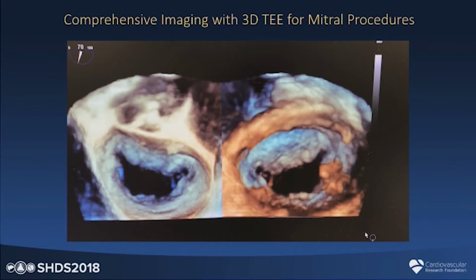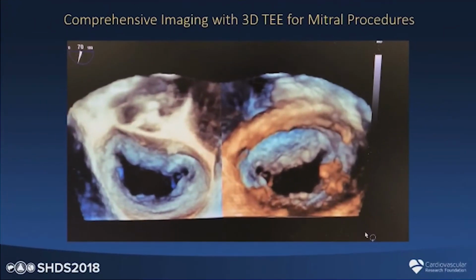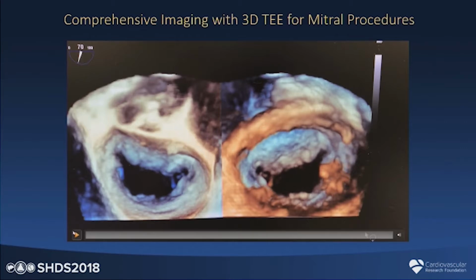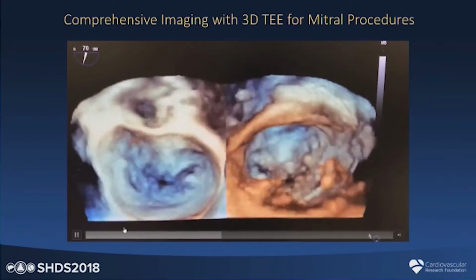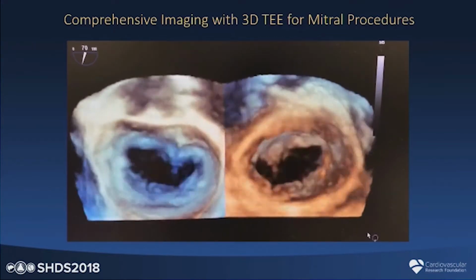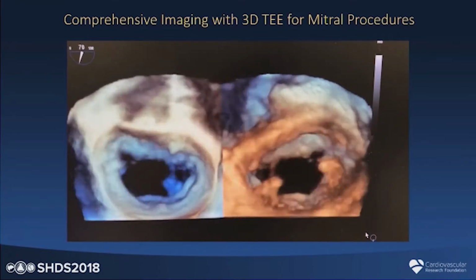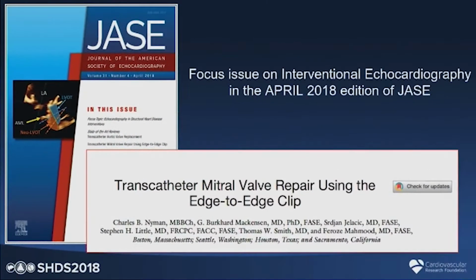Also useful is an opportunity to look at the mitral valve from above and below. Unfortunately, this is not playing, but it may display right here that you see a strut cord that's important to avoid. Now it's playing. So you have an en face view on the left, aortic valve on top, and the ventricular view on the right-hand side, showing the anterior leaflet, again, still on top. Very useful to assess anatomy.